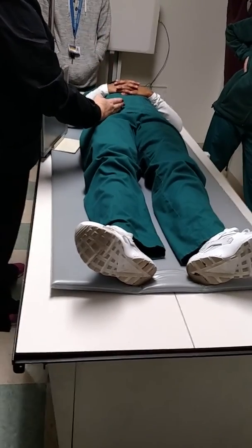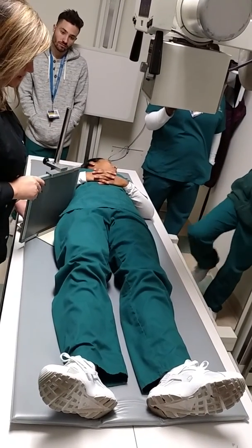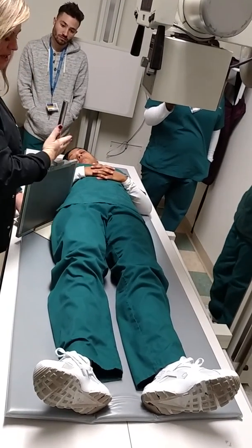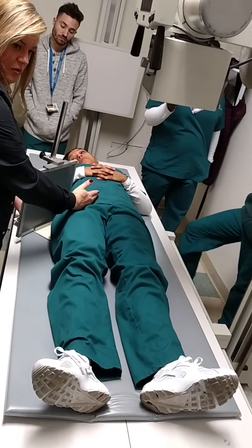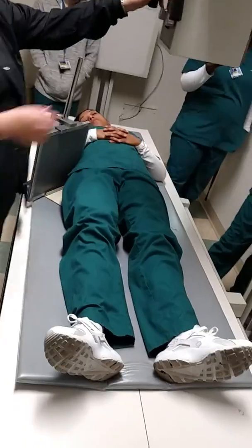The femoral neck sits at an angle right here. It doesn't sit straight up and down. It's not sideways like that. It's at an angle. So I have to take the cassette and put it at an angle. I have to make the IR parallel to the femoral neck. All right, and then I'm coming around that way.